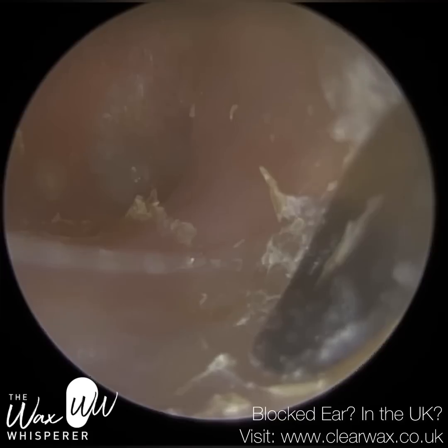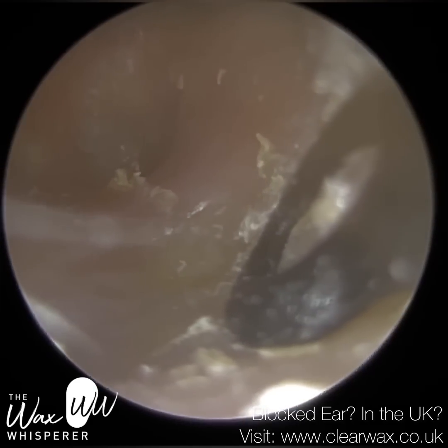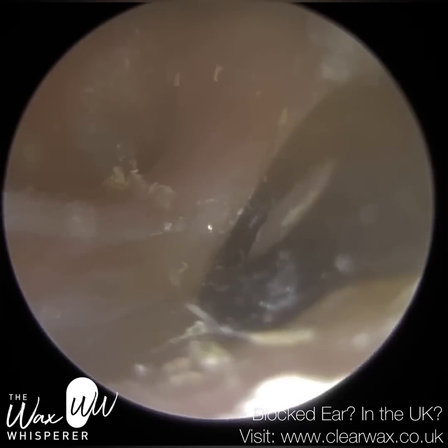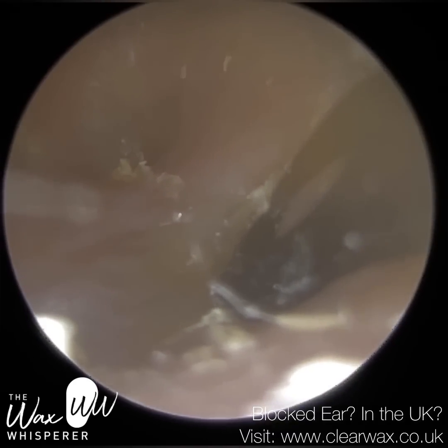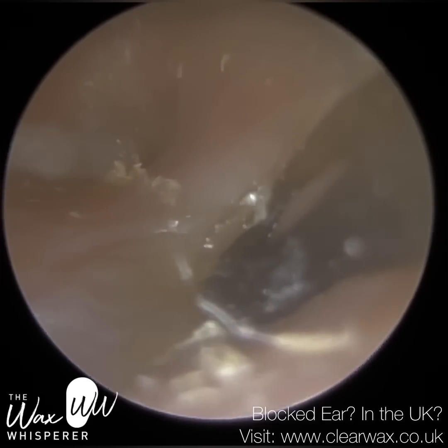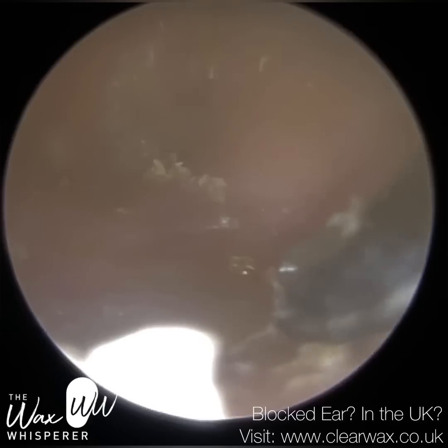So again, I'm just going to see if the right Curette helps here. I'm trying to just lift it underneath. It's a very thin layer. I think I've got underneath it now. Just slowly. And you've got to be controlled.